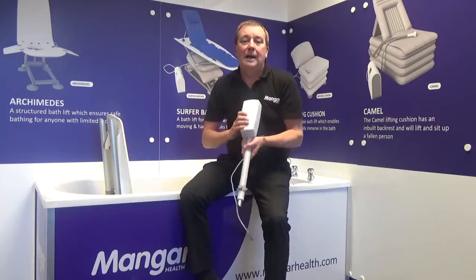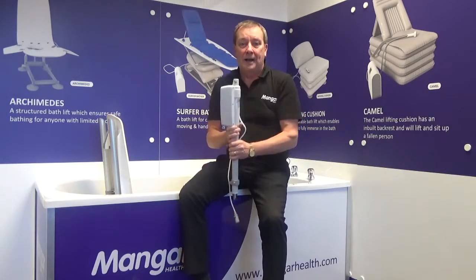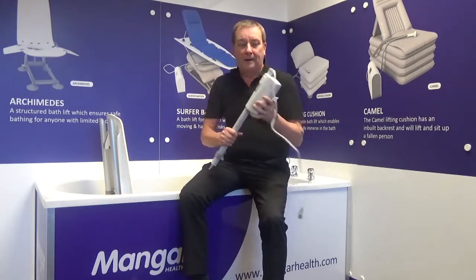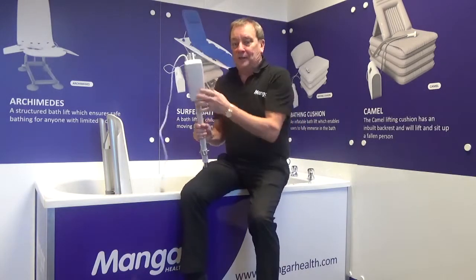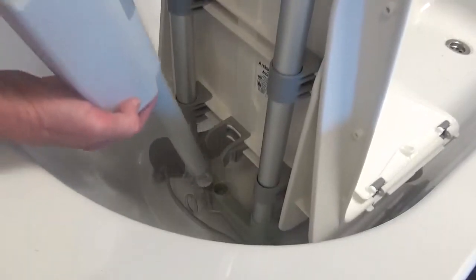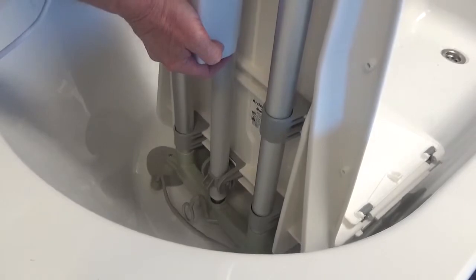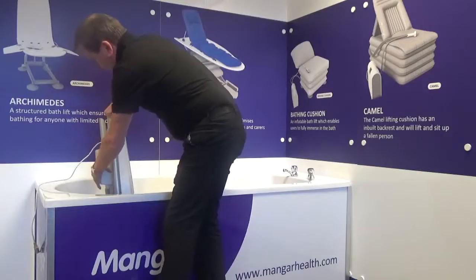The final thing to put into the bath lift is the actuator. And the actuator is the part that will spin round and turn and actually lift the seat. This will only go in one way, so don't worry. Box fits to the back, I lift up the seat, drop the actuator into the hole, lower the seat down, and it clicks into place. Quite simply, that's my bath lift ready to use.